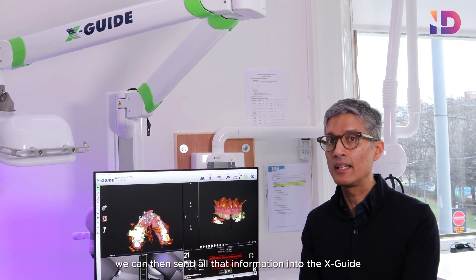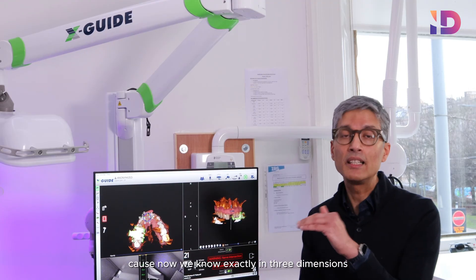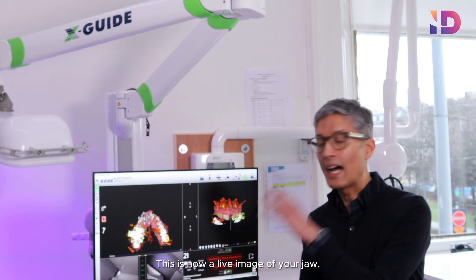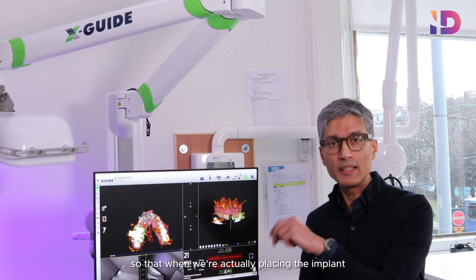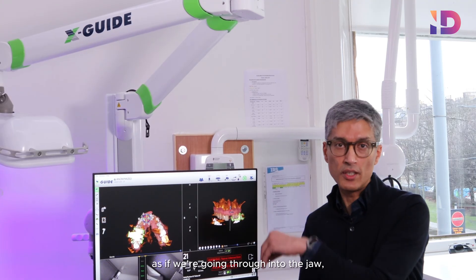Once we know that, we can send all that information into the XGuide, because now we know exactly in three dimensions where that implant needs to be. This is a live image of your jaw, so when we're actually placing the implant, we can see this moving as if we're going through into the jaw.